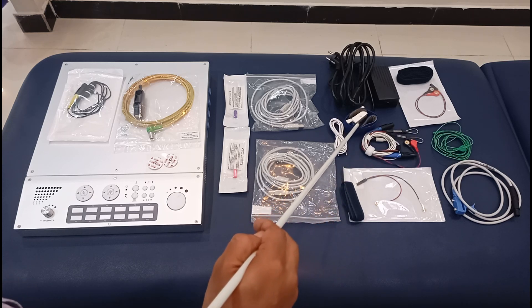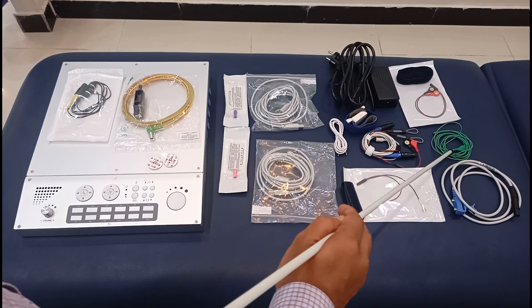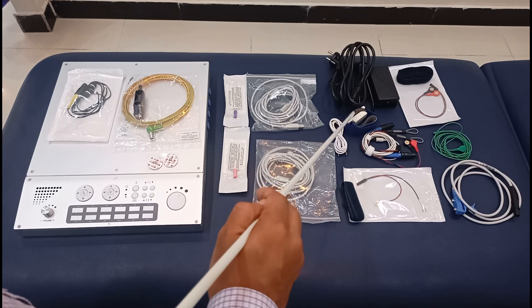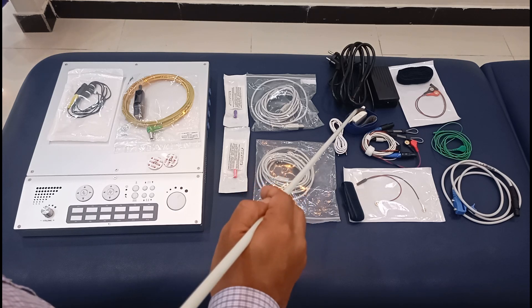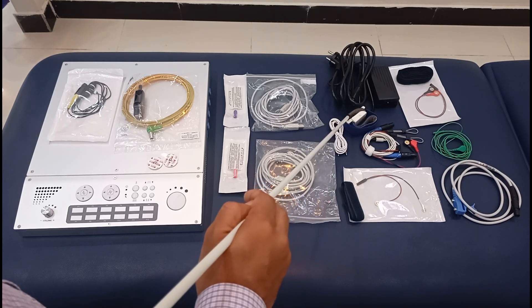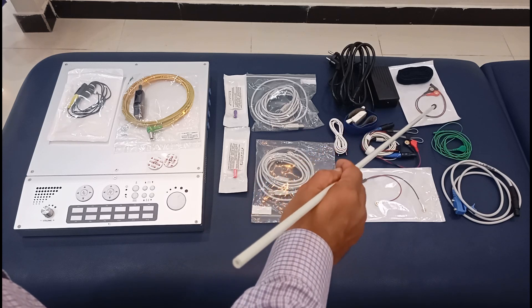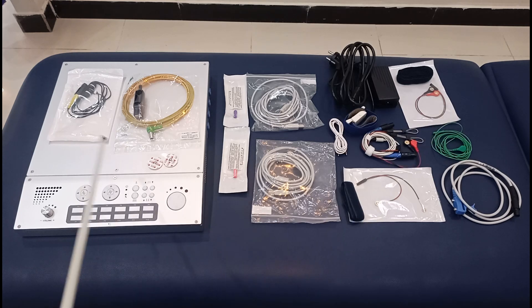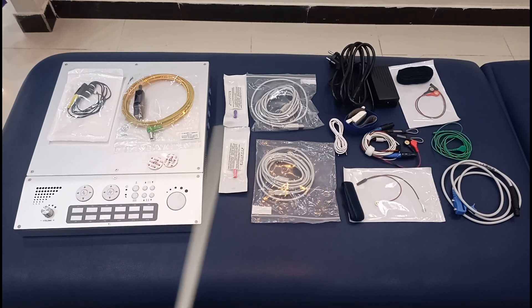This is the velcro for the ground electrode. The ground electrode can be connected to this, and the inside of this is soaked in water or saline solution. Similarly, you are also looking at the button electrodes. This is a brief introduction to the parts of this machine, though of course there are some other parts that come with it as well.